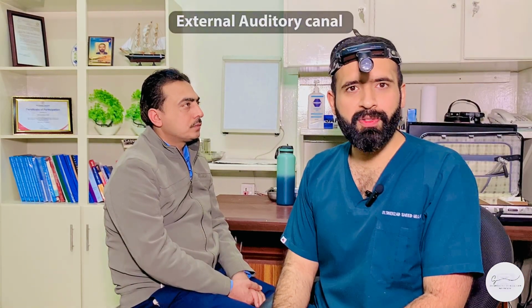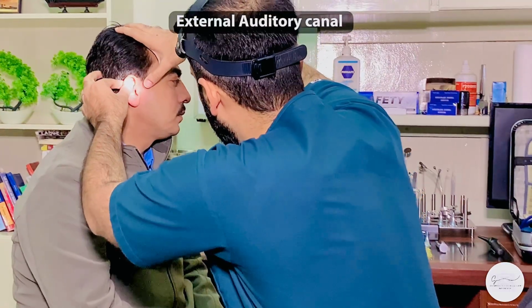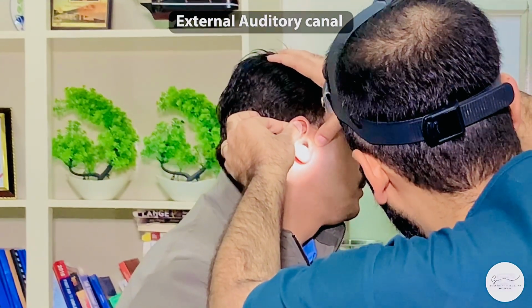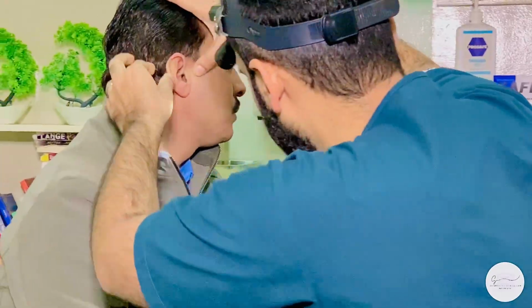After inspecting and palpating the pinna comes the examination of your external auditory canal. So in order to look inside the external auditory canal, you turn on the light source, you pull the pinna upward and backward, and with the thumb you pull the tragus slightly forward, and you have a clear view of what's inside the external auditory canal.